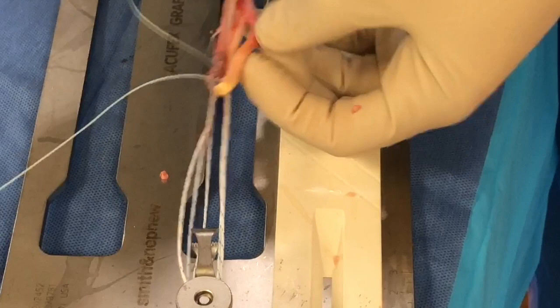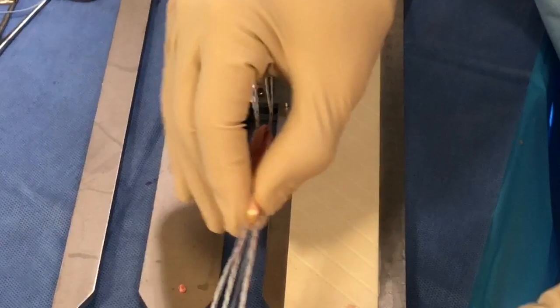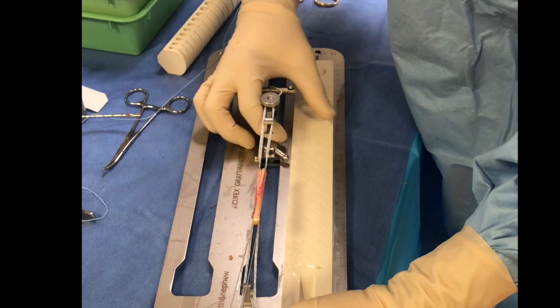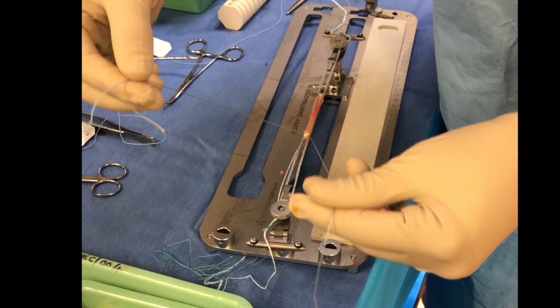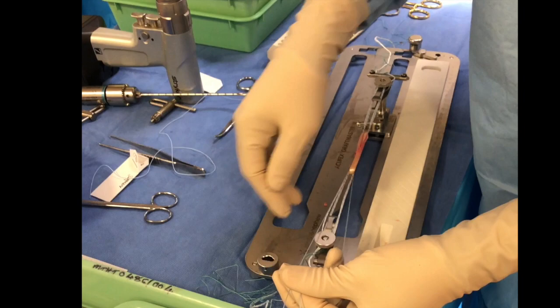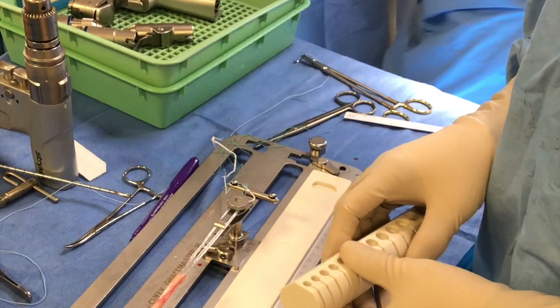So that the graft is incorporated into the folded pieces, you pass one end through the gap and that allows the graft to sit flush against the button. These end sutures will also be tied into the button at the end of the graft being prepared, and that allows for additional traction and also a second point of fixation.